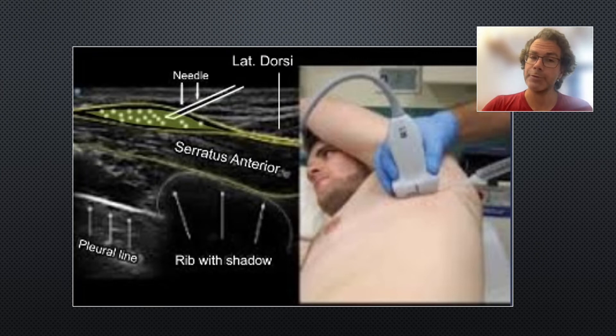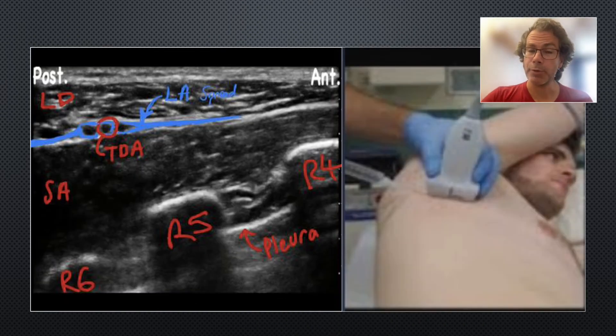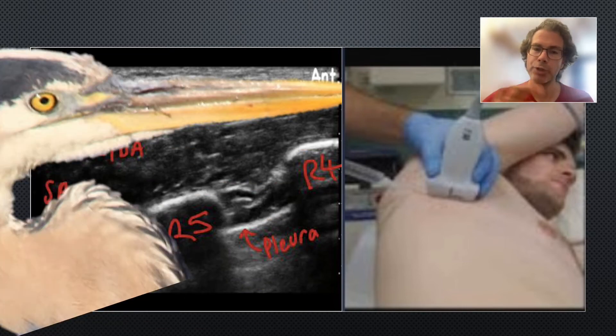Here's an example of a patient with left-sided rib fractures lying on his side with the rib fractures up. Anterior is to the left of screen. The key sonoanatomy landmark is the anterior aspect of latissimus dorsi — it tapers off anteriorly into a beak shape. You either go through lat dorsi or just anterior to it, but the key is to find that tapering beak of lat dorsi. Now with right-sided rib fractures, anterior is to the right of screen. We're slightly further posterior, so we can see more of the lat dorsi muscle and the thoracodorsal artery. Again, look for that beak-like shape of lat dorsi tapering off anteriorly.